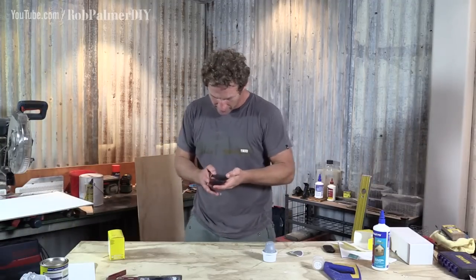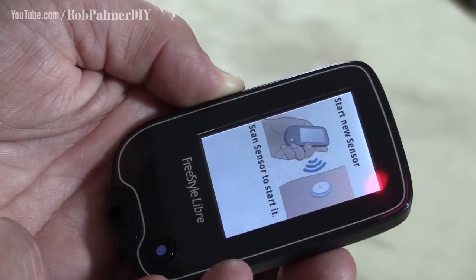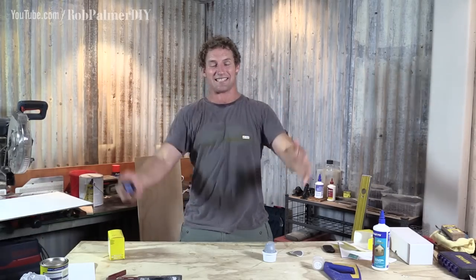Now, the machine. Start new sensor. Scan sensor to start it. New sensor starting up — can be used in 60 minutes. That's just this little guy doing a few stretches, warming up, getting ready to party for two weeks. Two weeks! See you in an hour.